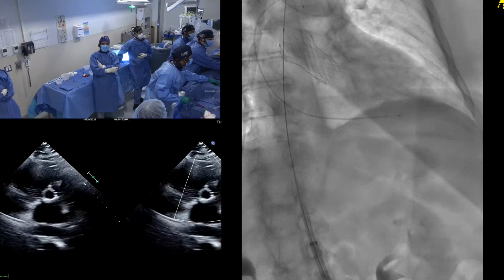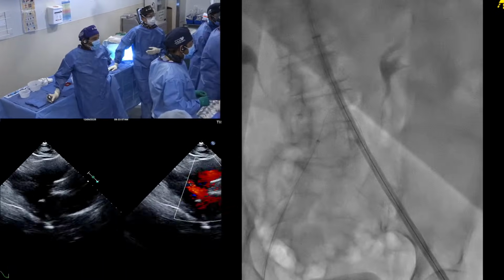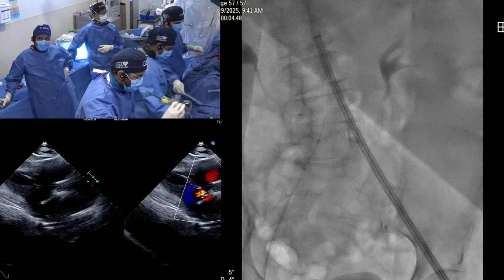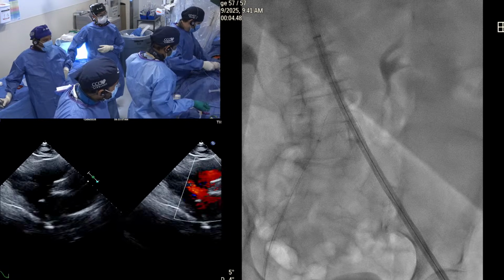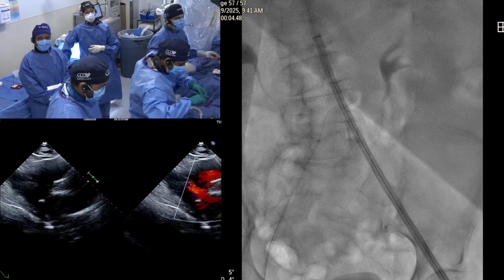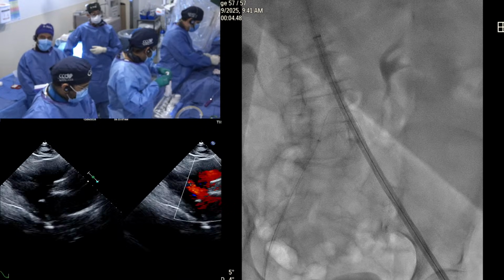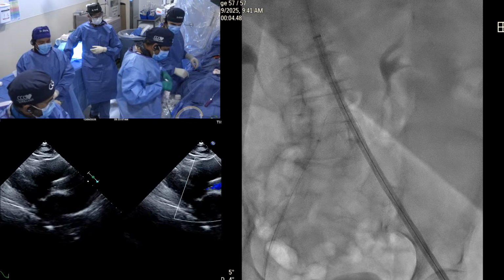But actually, in India, the number one valve is the MyVal, with more than 50% share. In India they are doing about 500 TAVR per month, and in one of the big regions almost 300 of them are with the MyVal, which is very cost effective. Of course, all other valves are available. Medtronic used to be number 2 quite a bit and still remains number 2. But the big part has been the MyVal. And somehow Edwards, while having 74% of the market share globally, has a very small number in India. So the MyVal, then the Evolut, and then it comes down to the Sapien. They're still using the Navitor quite a bit too.